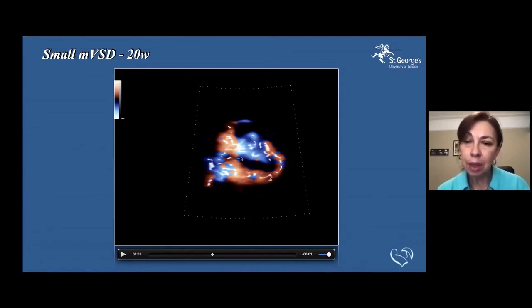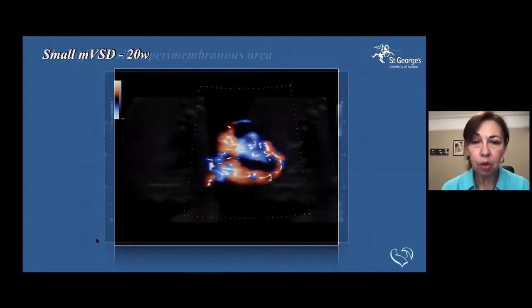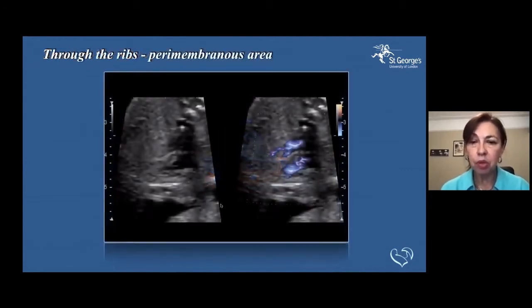So this technique here, if you use it in patients who have a higher BMI, it helps highlight the cavity separate from the ventricular septum, which is mostly intact with that apical VSD. So I would encourage you to start doing this just by reducing the gain.